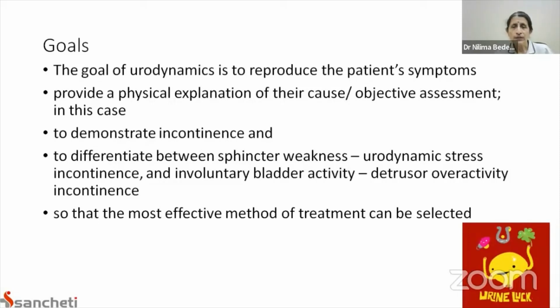So in the absence of detrusor contraction, whenever there is a leak on increased stress, that is genuine stress incontinence, and that is only tested with the urodynamic studies. So we are able to differentiate the type of incontinence, and we are able to differentiate what type of lower urinary tract dysfunction there is with the urodynamic test.